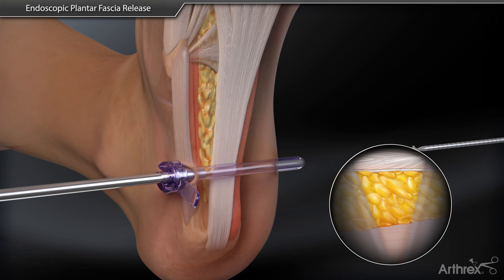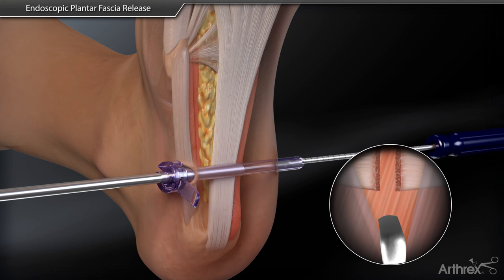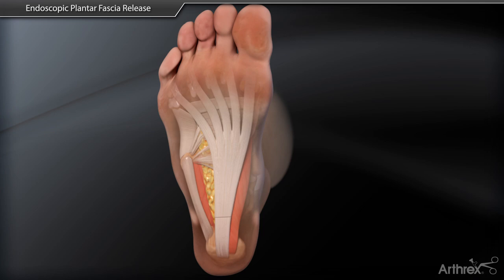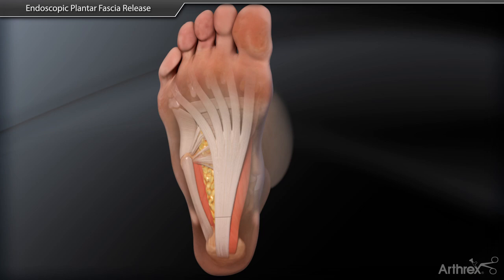Finally, a triangle or hook knife is inserted medially and a release of the central band is performed in a slow, controlled manner from a lateral to medial direction. Following confirmation of an adequate release, the instruments are removed and the incisions are closed with suture.